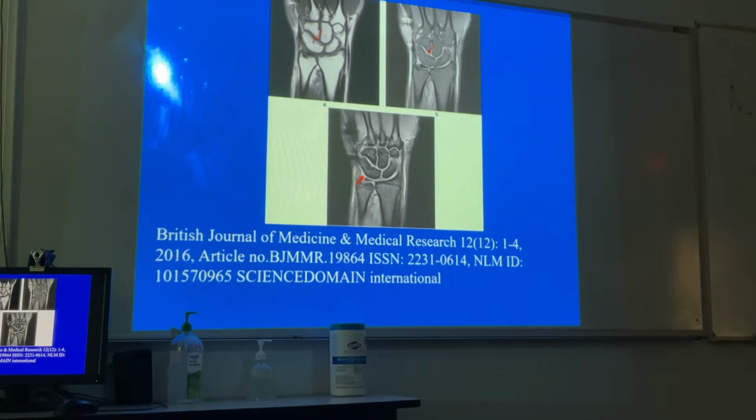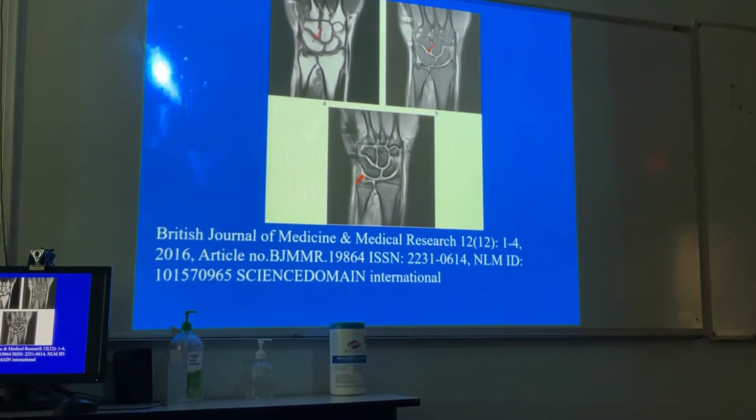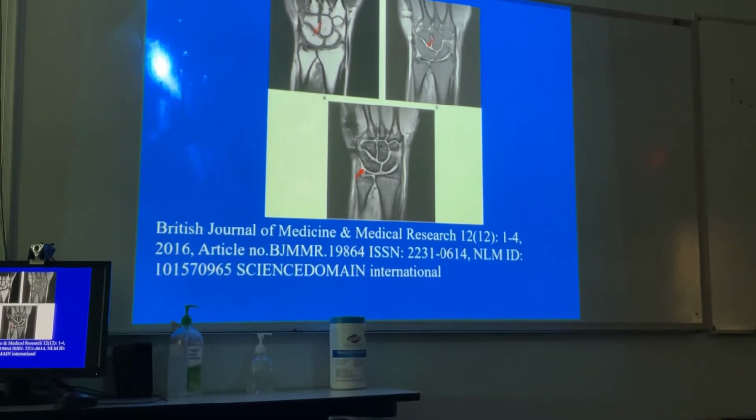Now this is the patient who's had pain on the ulnar side for the last 6 months. Nothing helps, they need an MRI. Can they do a ulnar deviation view in the MR scanner? Sure they can. Okay, they'll try and stress it.